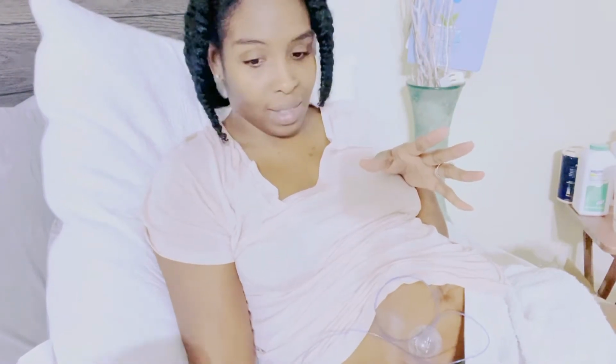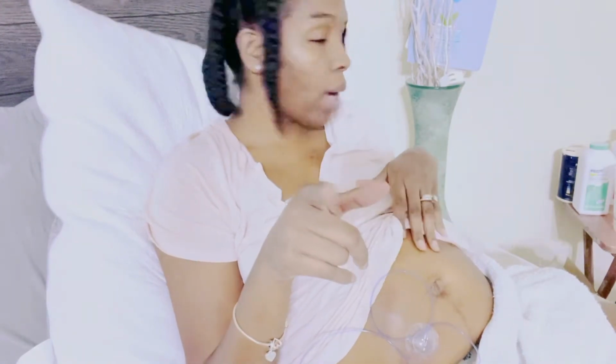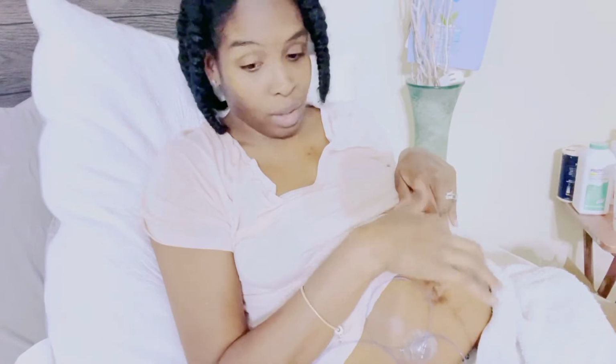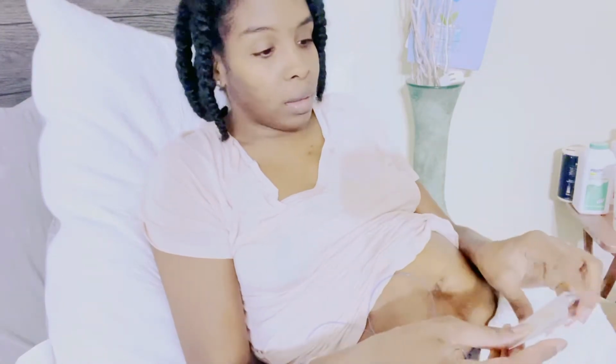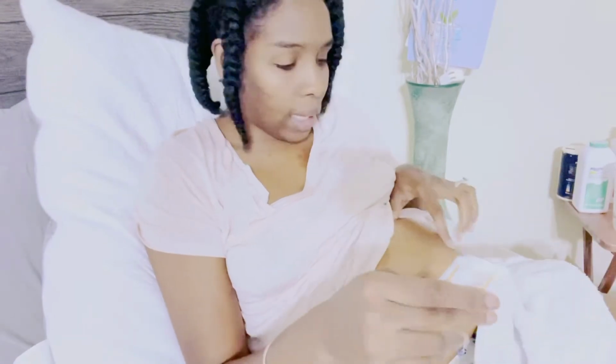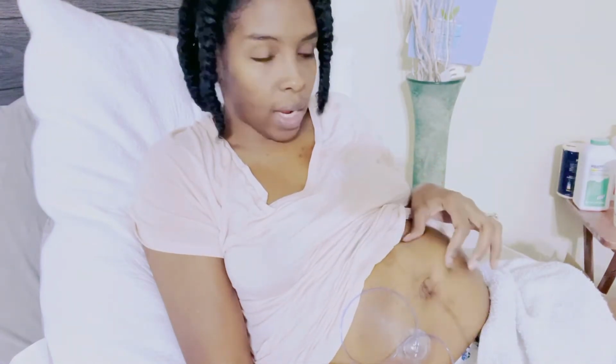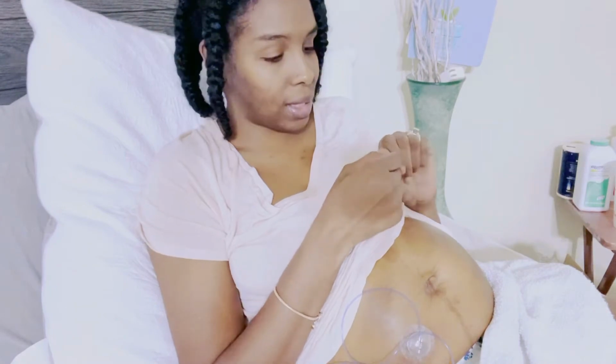It hurts so bad to me. Oh, I forgot to get some ice, because the ice does take some of the pain away. So I like to numb my area with ice now. If I numb it with the ice for like a minute before I do it, then it doesn't hurt as bad going in. But since I already started my video, I'm not going to go get some ice.